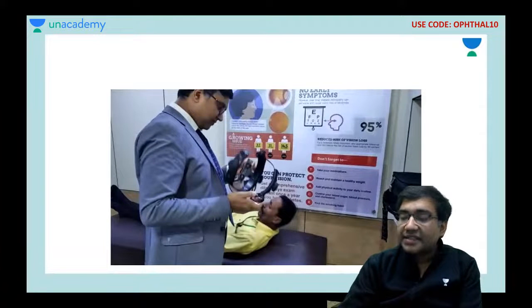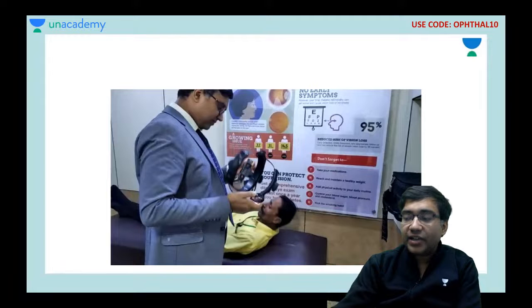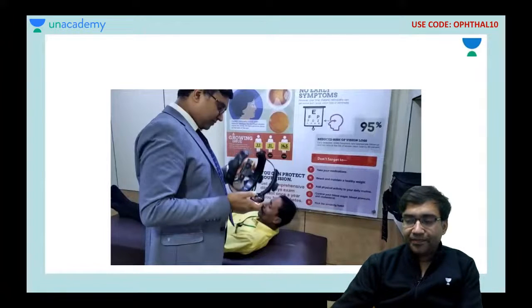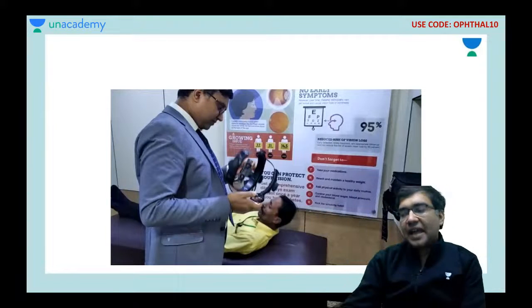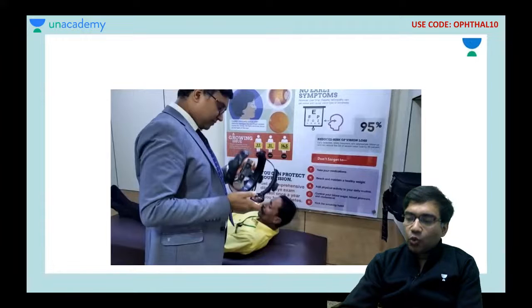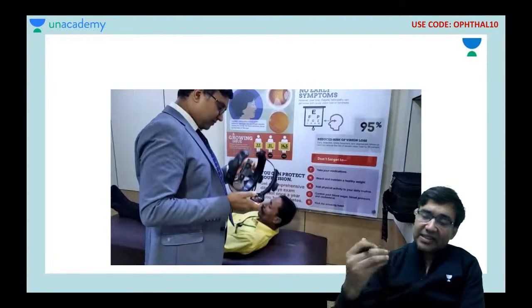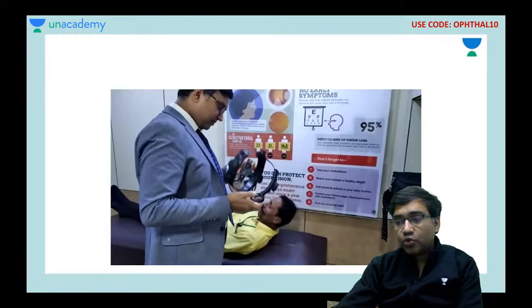Now what is the basic advantage and the disadvantage of indirect ophthalmoscopy? Can anyone of you tell? Just tell me in the comment section. So we have a smaller, cheaper direct ophthalmoscope with us. So why do I need an indirect ophthalmoscopy, which basically has more learning curve than a direct ophthalmoscopy?